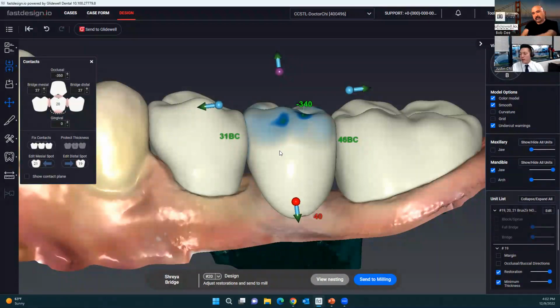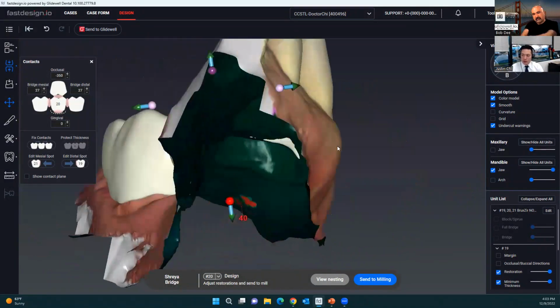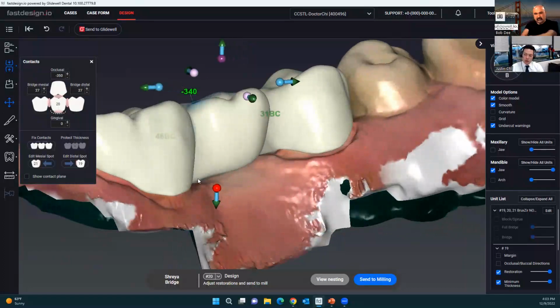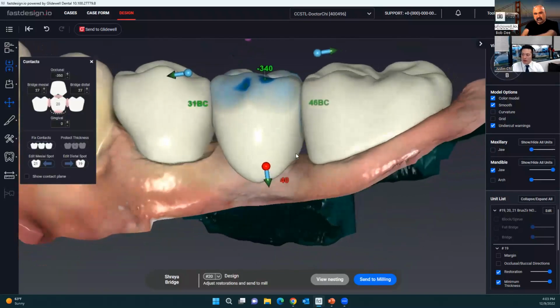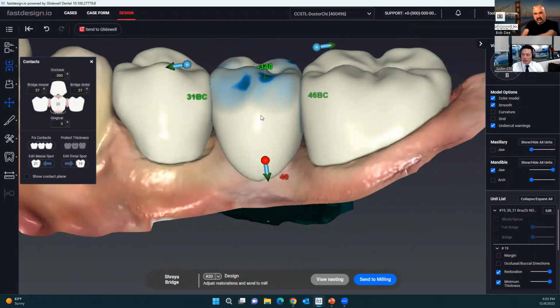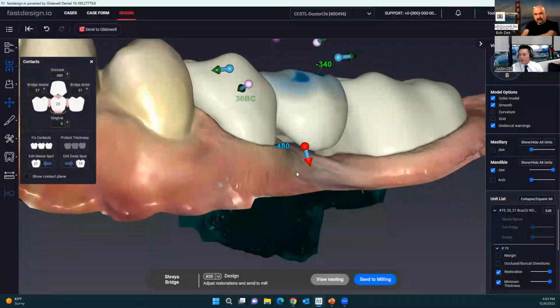I'm glad you asked that. You absolutely can. As far as pontic design, you have the freedom to make this. What the software typically will default to is a modified ridge lap or slight ridge lap. So that's kind of what we have going on here. But if you want it hygienic, notice how when I click on the tooth itself, this is an introduction to another tool. This is move, rotate, scale here on the left with the arrows. Notice how there's arrows around the design. And so now at this gingival region, I can just expand this upwards and you can lift the whole gingival portion above the tissue.